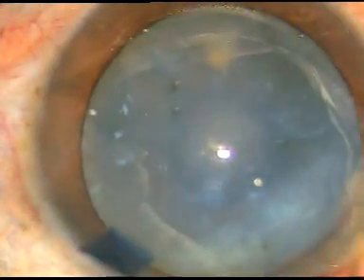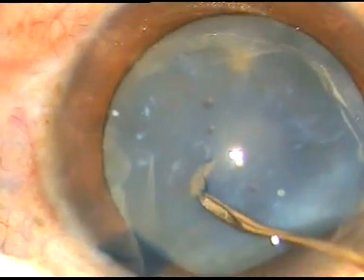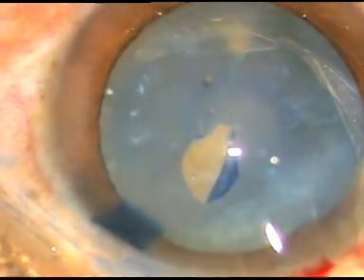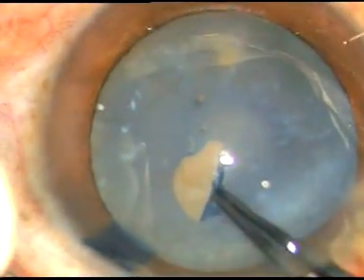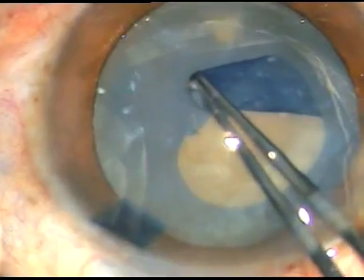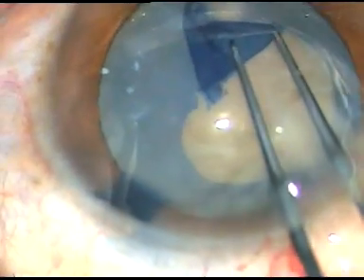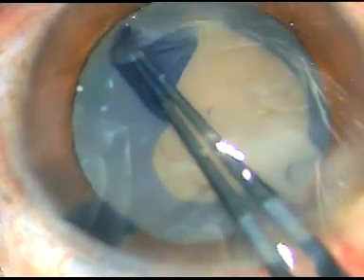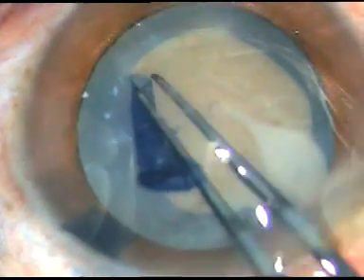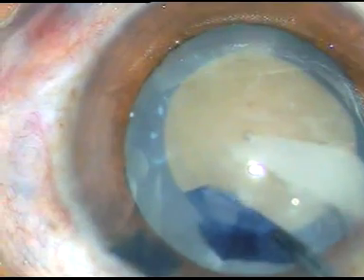Here it is. I incise the capsule, raise the capsular flap, and now I use Utrata forceps. Hold the forceps and see what happens — as I go near 9 o'clock, milky fluid comes out. So the cortex has liquefied and turned into a milky material. That is why this is a hypermature Morgagnian cataract.